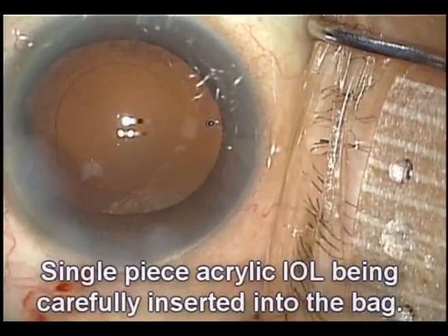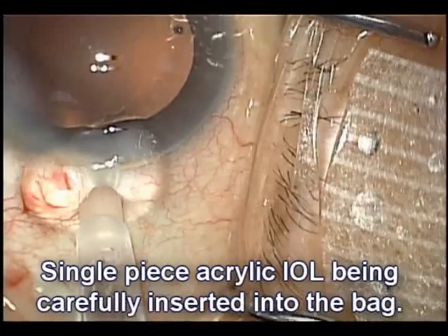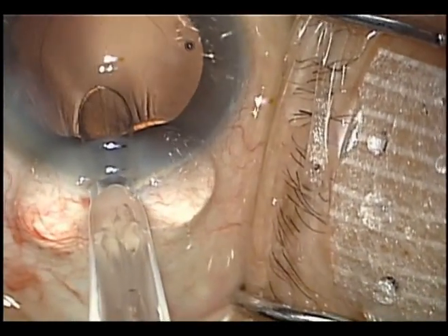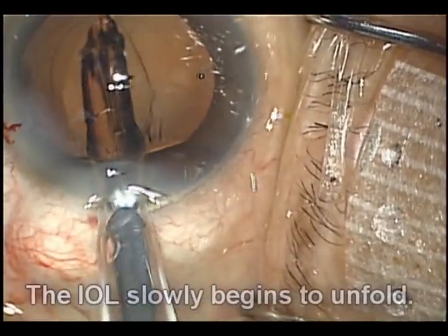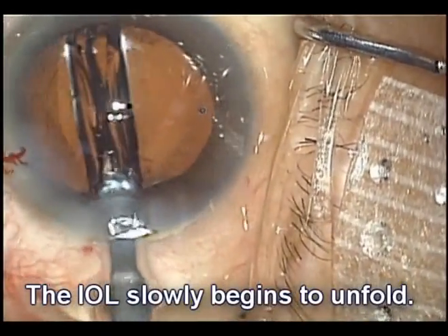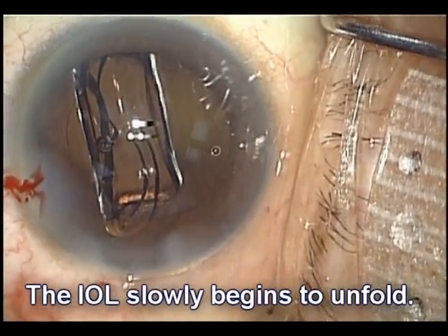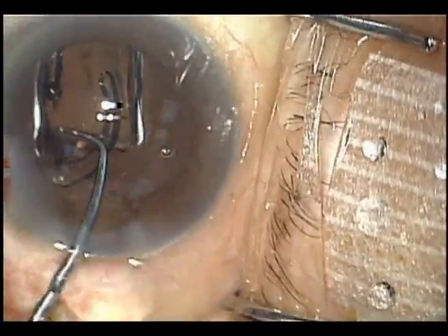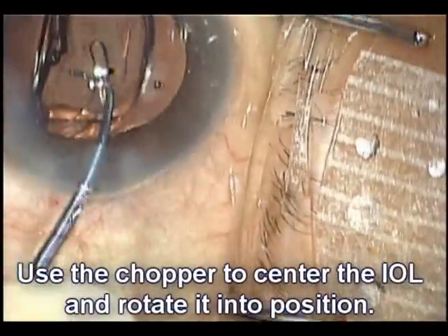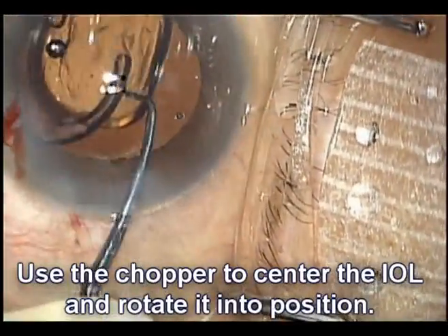We're going to put a single-piece acrylic lens inside the capsular bag. We lift the incision, apply counter traction. There's the injector tip, and we'll slowly advance the lens. The lens goes in the capsular bag. We'll use our chopper to help completely place the lens in the bag. It slowly unfolds as the haptics go into position. Everything looks pretty normal here.